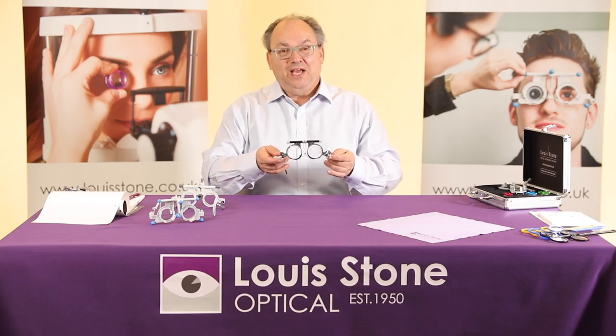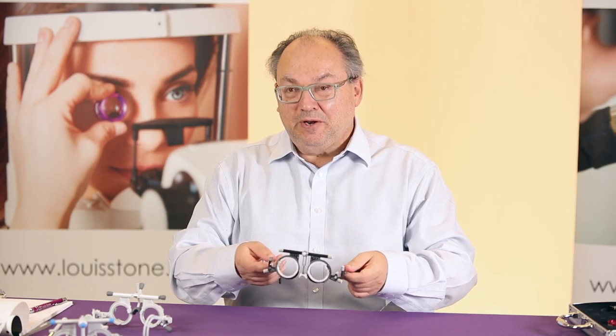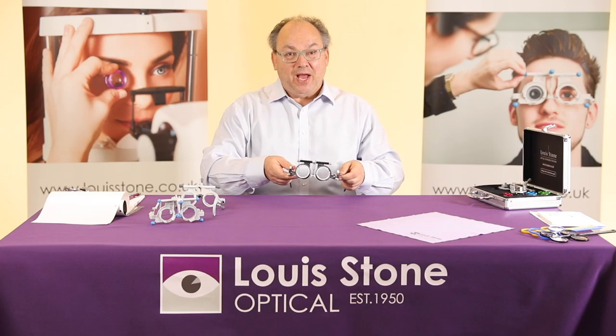Oculus have re-released it. It's made of aluminium, it's a lot lighter, and it's also proved to be a lot more popular. The bridge has been improved and it also comes with two extra bridges.